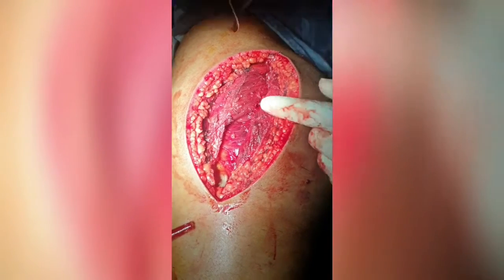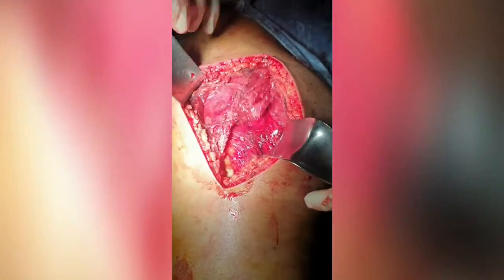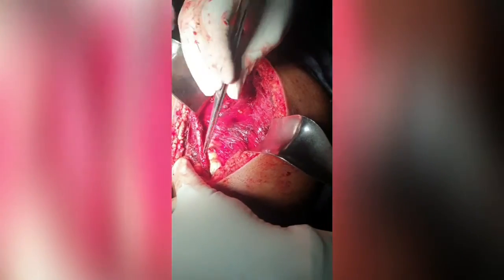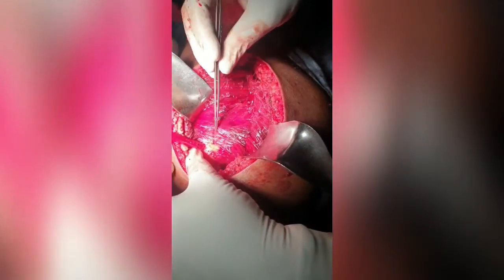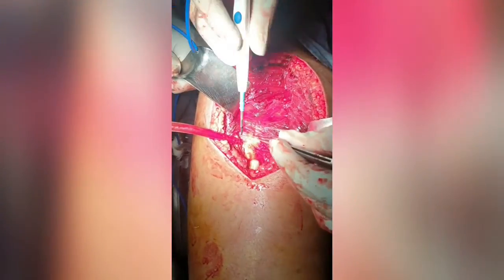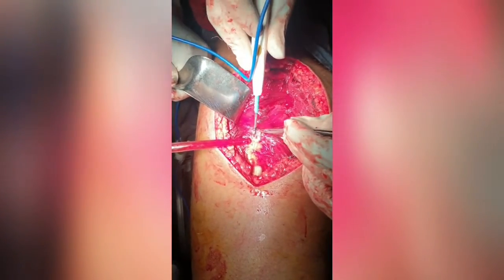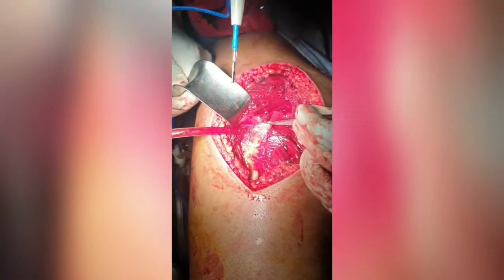So we have just divided the gluteus maximus into two halves. This is the anterior half, this is the posterior half, this is the tensor fascia lata, and this is the subgluteal bursa and fat. We will now remove the subgluteal bursa and fat to expose the short rotators of the hip.